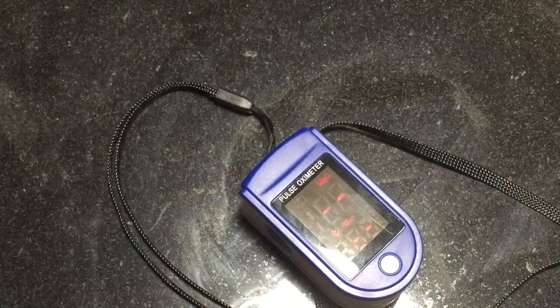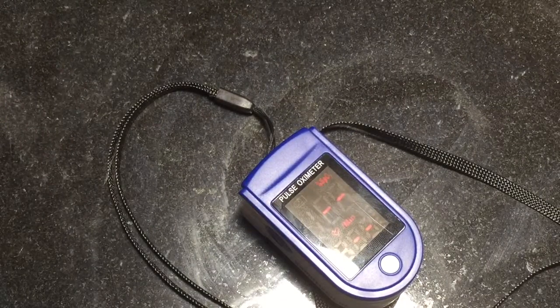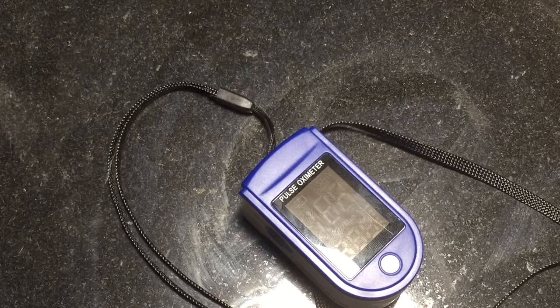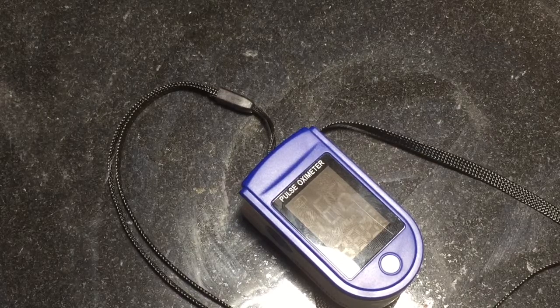It even comes with this easy-to-read guide so that you know what the numbers mean. It does not tell you things like what the normal range is, though.